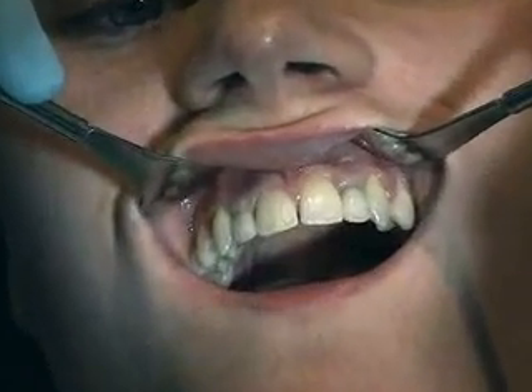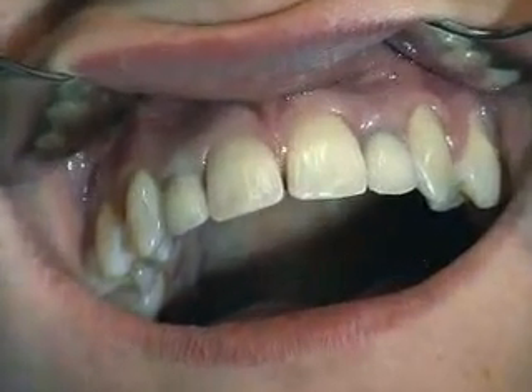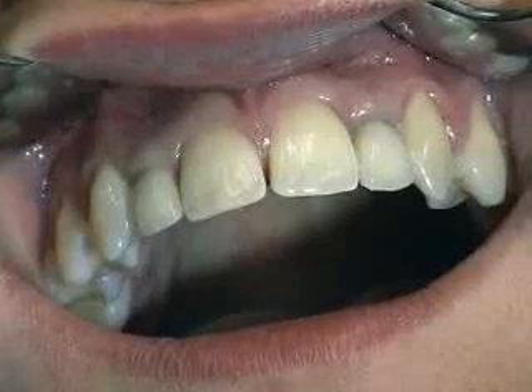As we can see, the Straumann dental implant system offers maximum aesthetics while preserving natural tooth structure.